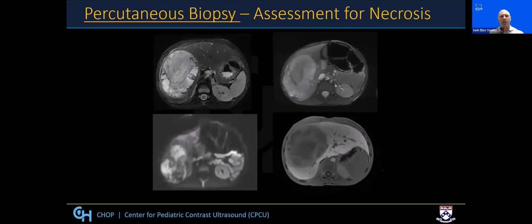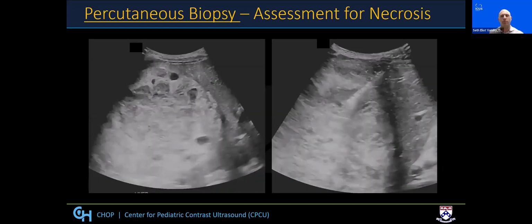Now, on MRI examination, you can see that the area does restrict with T2 hyperintensity, is somewhat gelatinous in appearance, and there's still that peripheral enhancement, but no central enhancement. So we proceeded to go on ultrasound-guided biopsy after obtaining the MRI. And while we discussed the potential use of contrast-enhanced ultrasound for the biopsy, our biopsy yielded pretty well-organized cores. And we deemed it unnecessary to do the CEUS. Pathology initially thought it was going to be sufficient.